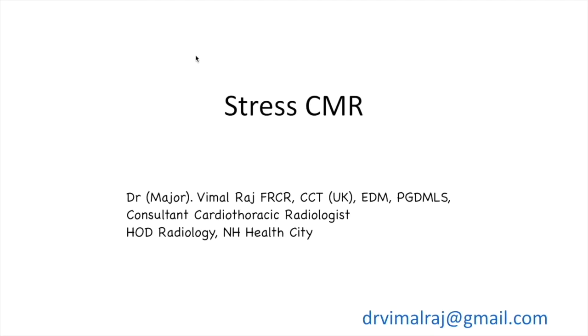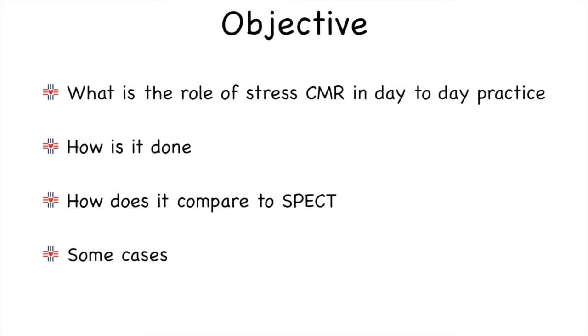Welcome to this session on stress cardiac MR. The objectives of the session are to establish the role of stress cardiac MR in day-to-day practice, explain how it is done, and how it compares with SPECT perfusion imaging, and to show some cases.